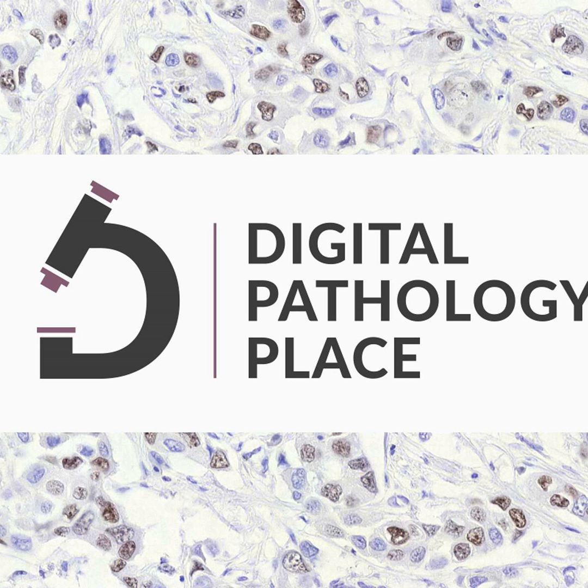And let's do that as I talk to you about the Immunoscore, redefining the landscape of colorectal cancer control and care. So the Immunoscore, introduced by Jérôme Galon in the early 2000s, evaluates immune cell densities, keyword densities, within tumors, offering a more accurate prediction of clinical outcomes in colorectal cancer compared to the tumor node metastasis, the normal tumor node metastasis system.